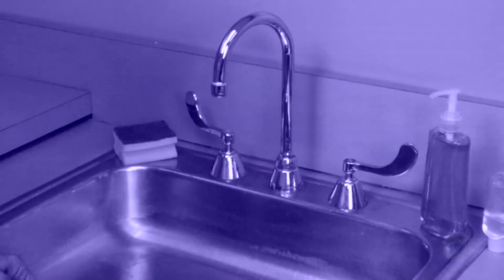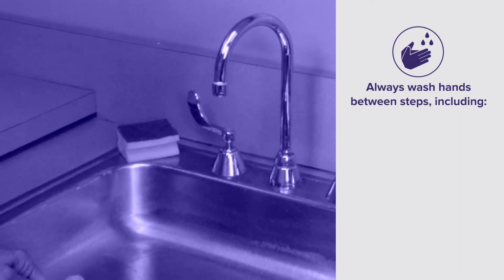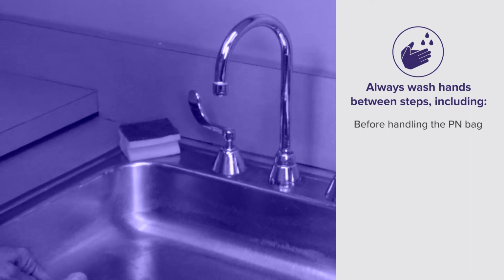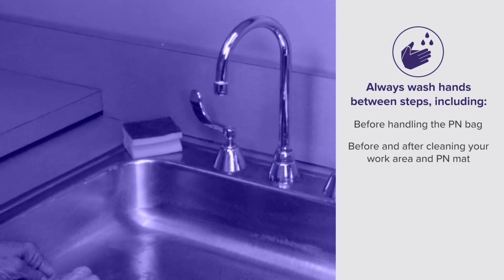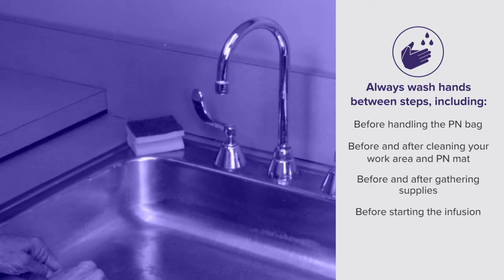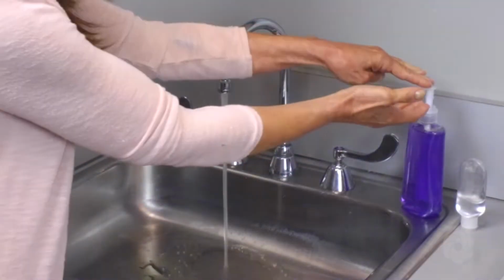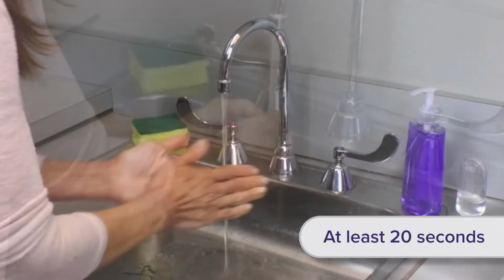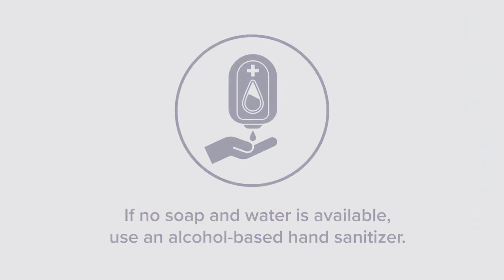It is very important to clean your hands between every step of the PN preparation process, including before handling the PN bag, before and after cleaning your work area and PN mat, before and after gathering supplies, before starting the infusion, and whenever you think your hands may have become contaminated. Clean hands thoroughly using soap and warm water. Follow by drying hands with a clean towel. If no soap and water is available, use an alcohol-based hand sanitizer.